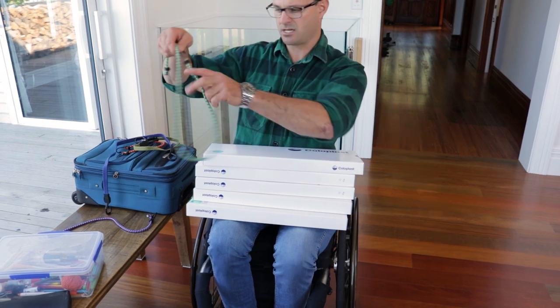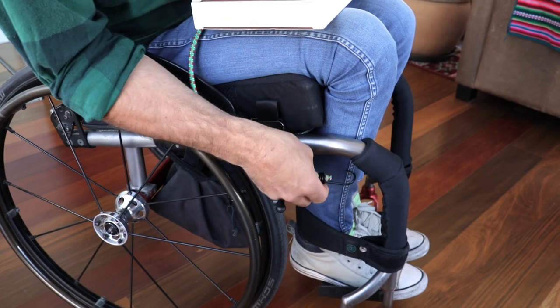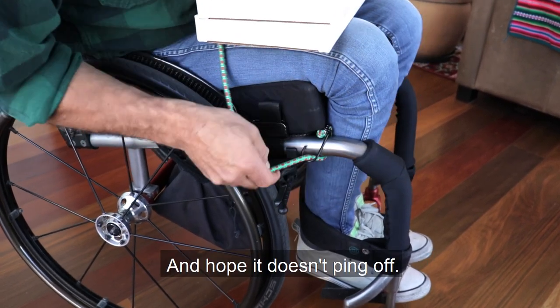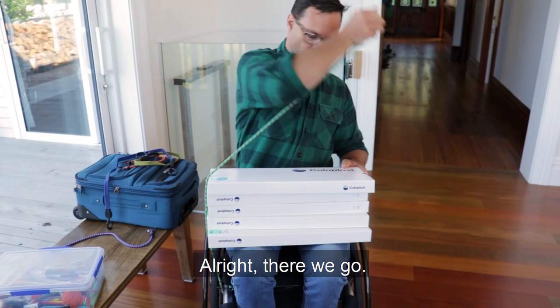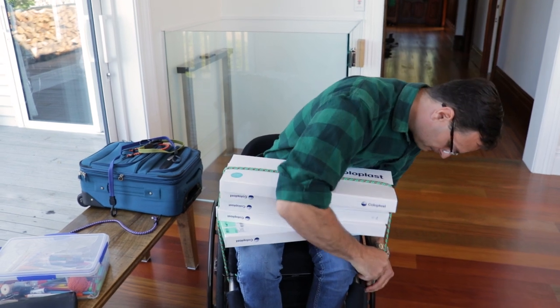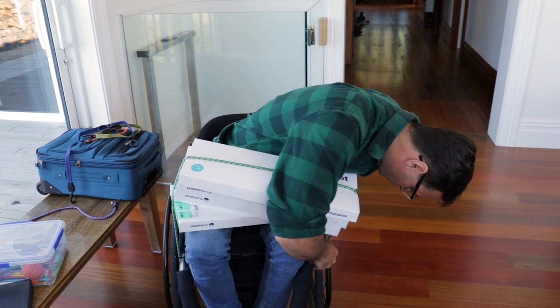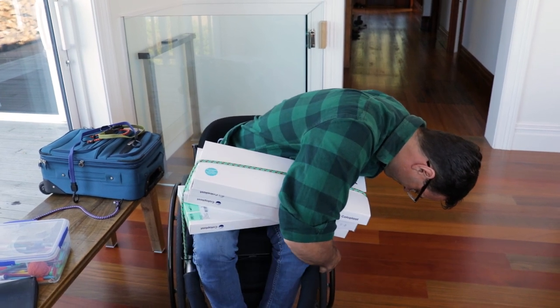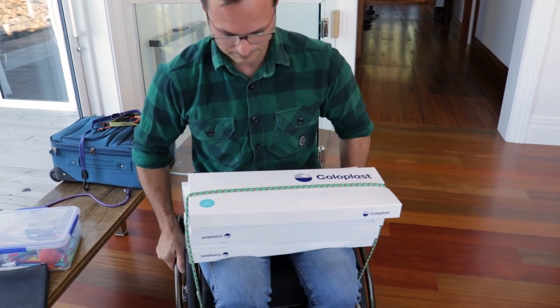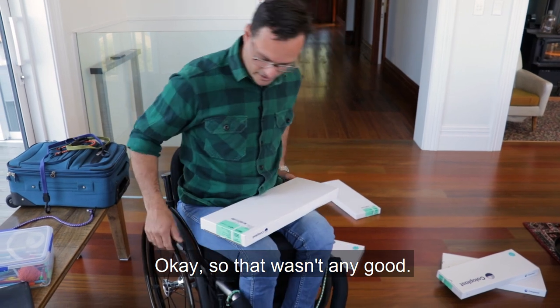So this is a longer bungee. We'll do that whole process again — wrap that round on itself, and hope it doesn't ping off. There we go. Now, how do I hook that round there? I could hook that round my brake. Okay, so that wasn't any good.